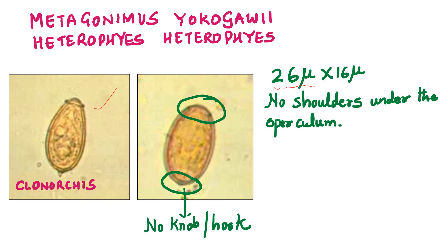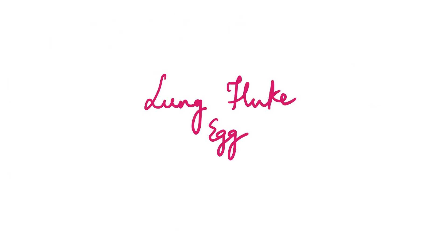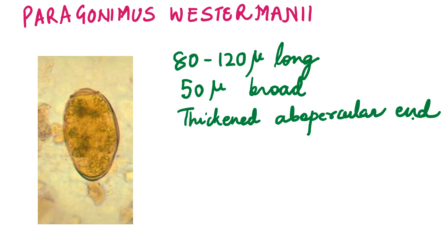Let's move on to the lung fluke — Paragonimus westermani, the Oriental lung fluke. The eggs are passed out in the sputum, and sometimes when the patient swallows the sputum, the eggs are also demonstrable in the stool. The opercular end is slightly flattened, though that is difficult to appreciate. The eggs are 80 to 120 microns — somewhere between small-sized and big-sized eggs — and the ab-opercular end is thickened. This finishes those fluke eggs which are operculated.